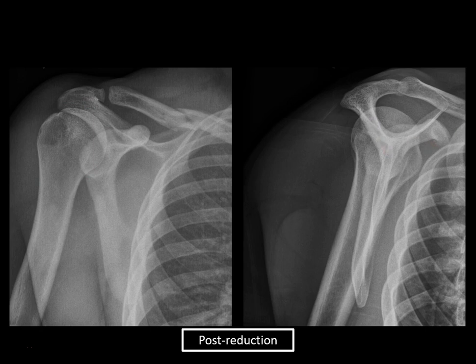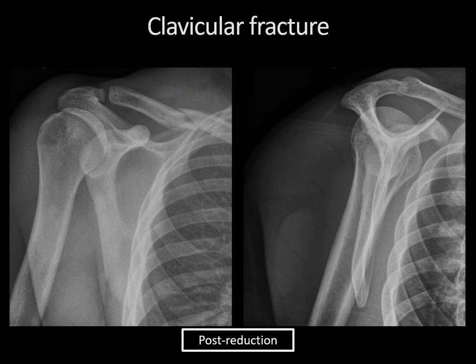On the scapular Y view, the humeral head is now perfectly positioned over the glenoid. There's a comminuted fracture of the right clavicle, much easier to see on post-reduction images. In the setting of a posterior shoulder dislocation, just like with anterior dislocation, certain fractures should be sought — specifically a reverse Hill-Sachs lesion, an impaction fracture of the anterior medial humeral head, and a reverse Bankart lesion, a posteroinferior glenoid fracture as opposed to anteroinferior. These are sometimes better seen on CT scan, and in this case we don't see any radiographically.